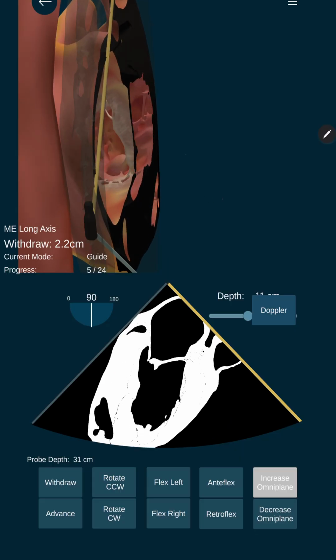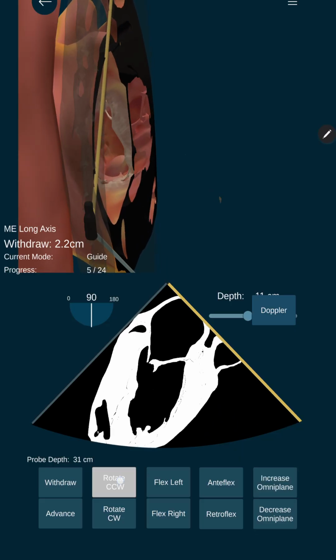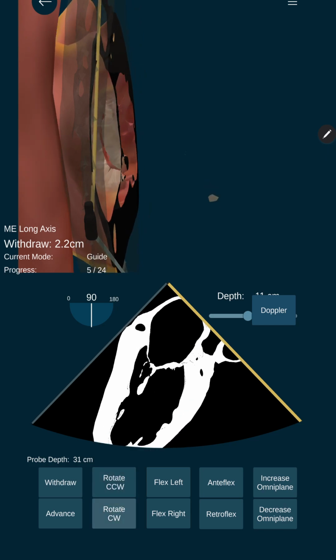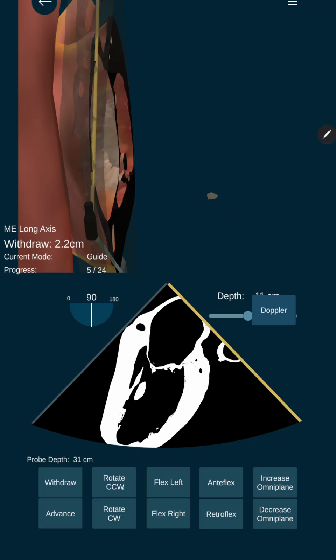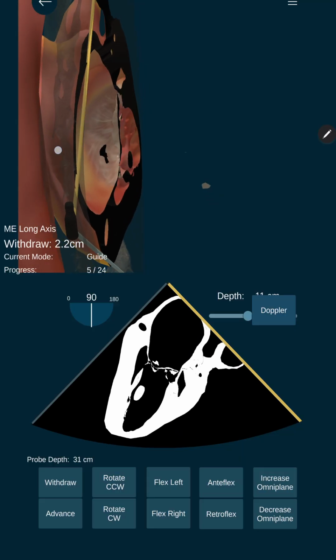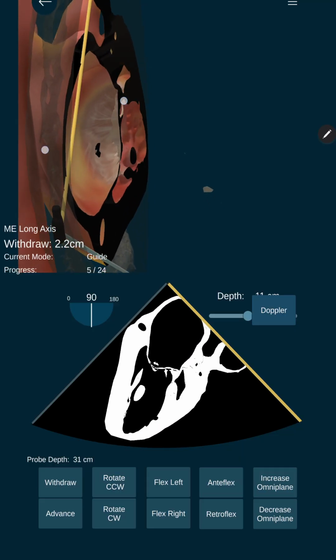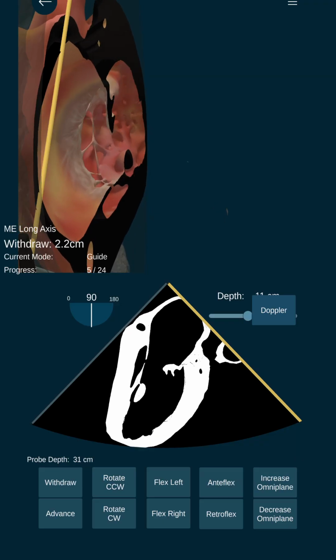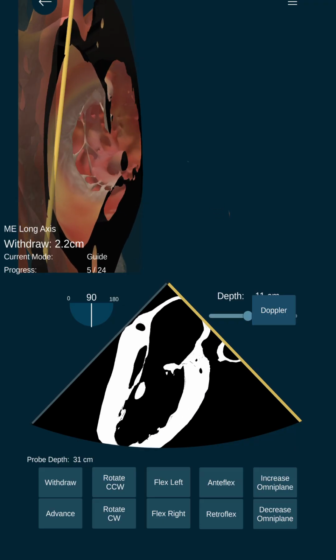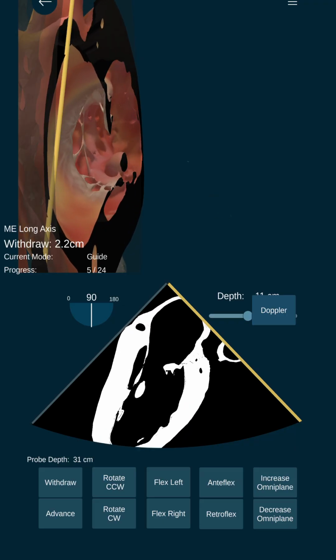That is at 90 degrees with a little finer adjustment: the whole of the anterior mitral leaflet and the P3 segment of the PML. A little zoom, better. So all of the anterior mitral leaflet and part of the posterior mitral leaflet, that is the P3 segment.